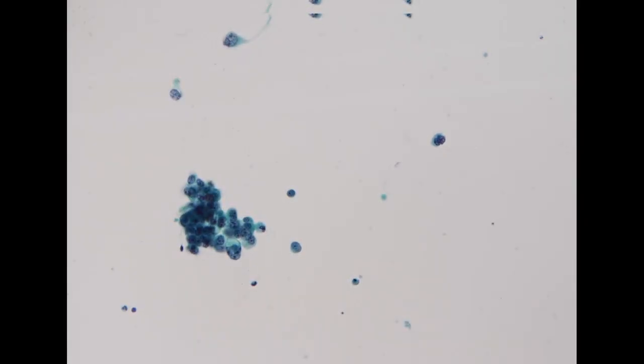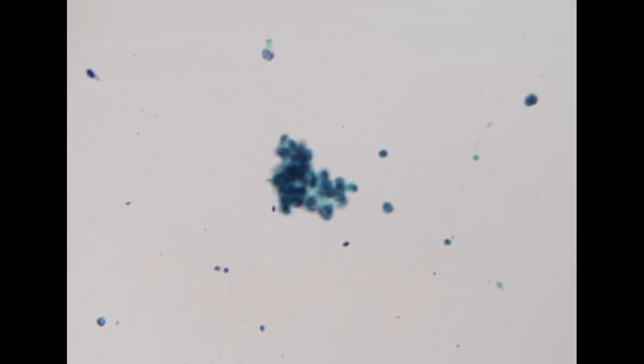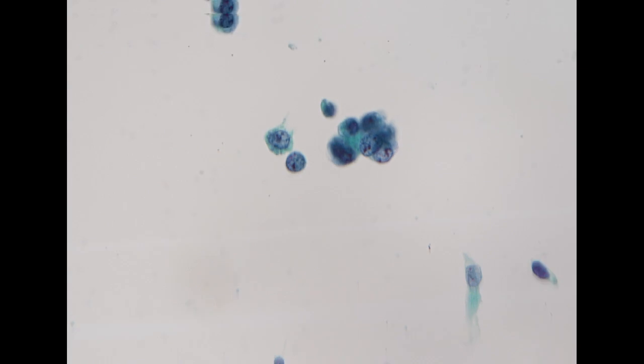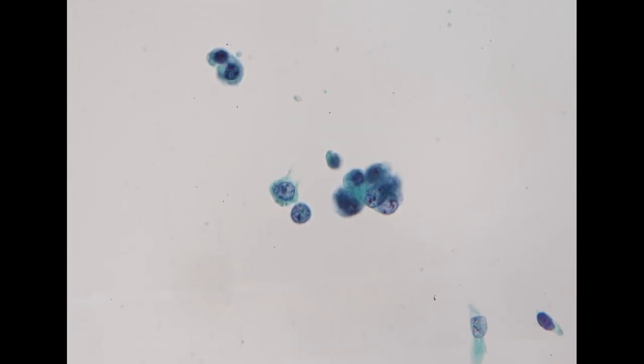For a benign urine washing cytology specimen, we expect to see a significant portion of the cells being umbrella cells, with big cells but a low N/C ratio. However, in this specimen, we almost never see umbrella cells.